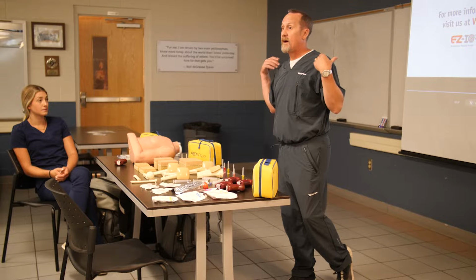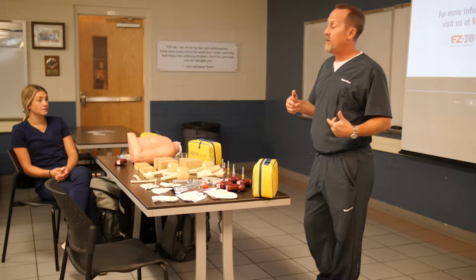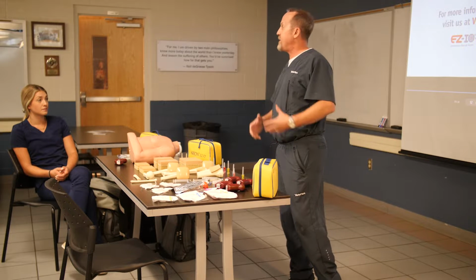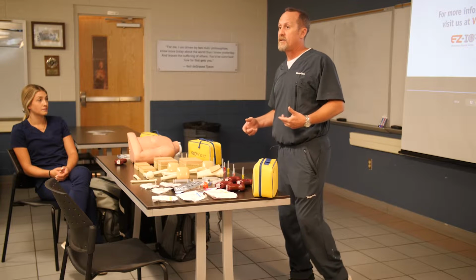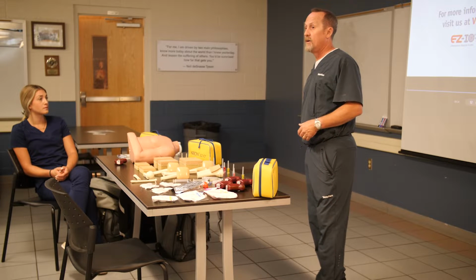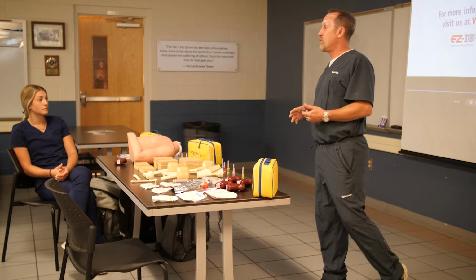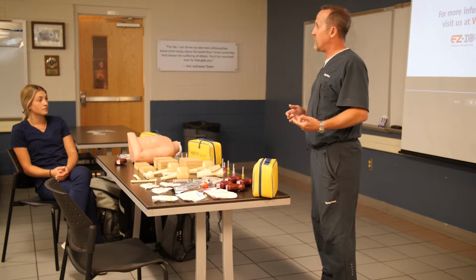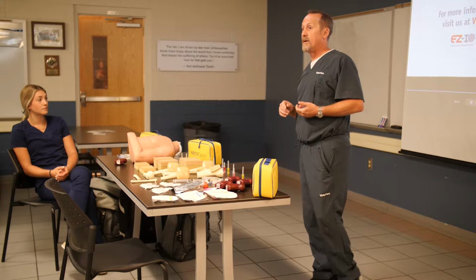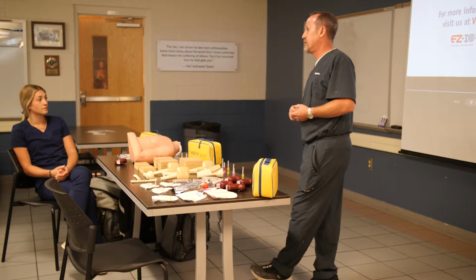But if we send them into the hospital and they have a proximal humerus IO, and we have good flow, they can keep that in there for 2 days, which gives them the ability to get them up to the ICU, open that sterile field, and go through that methodical process of putting a central line in, and then that central line can stay in for up to 7 days typically. So a very, very important thing to remember, it's a bridge to a gap. Now with adults, 21 years and older, it's 48 hours dwell time, and pediatrics, considered 21 years and younger, is 24-hour dwell time. So you guys have a significant amount of time that this can last, okay?